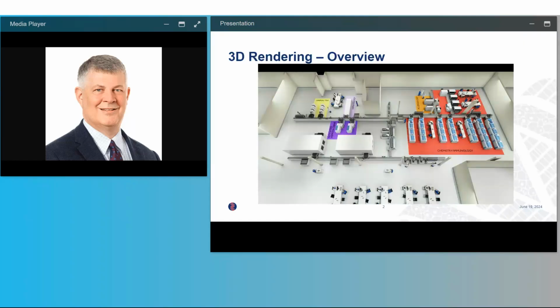So when we were considering laboratory automation, I thought, here we'll start with where we ended up. There were a lot of considerations and a lot of factors. Where we ended up was beginning with the core laboratory, and this is an artist's rendering of how our laboratory is laid out. You can see that in the upper right-hand corner, we automated our chemistry, immunology, and allergens, and then on the left side, we have urinalysis, hematology, the A1C platforms, and high volume storage units.